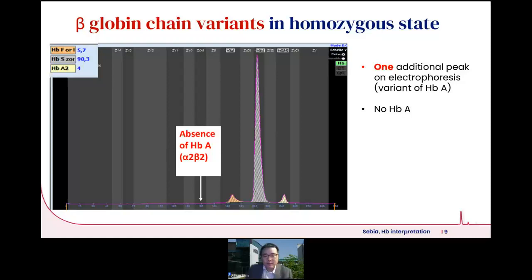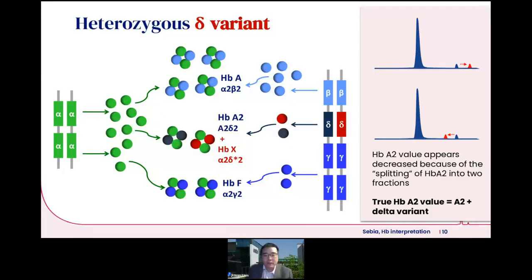So once again, in the homozygous beta variant situation, you do not see the hemoglobin A, and you see an entirely shifted position of the mutant hemoglobin A, right? How about the situation of a heterozygous delta variant? So the delta gene, there are only 2 copies of them. So like the beta variant, you would actually see the hemoglobin A2 being split into 2.